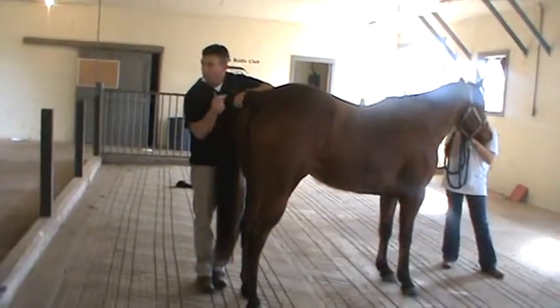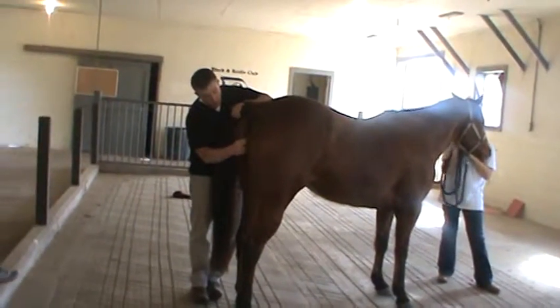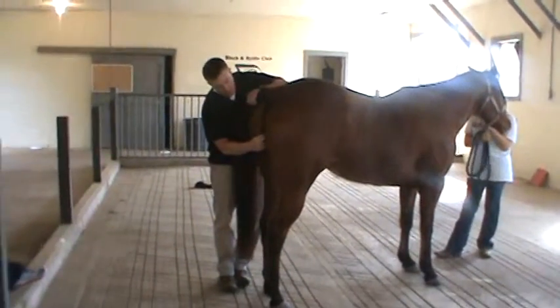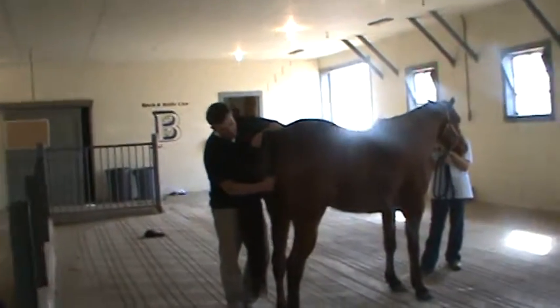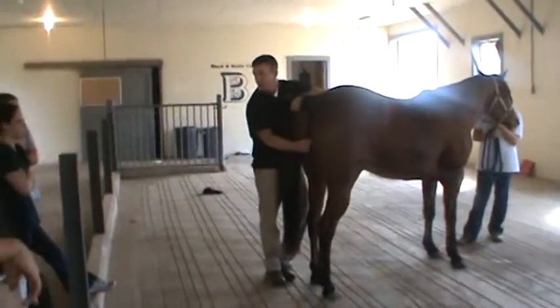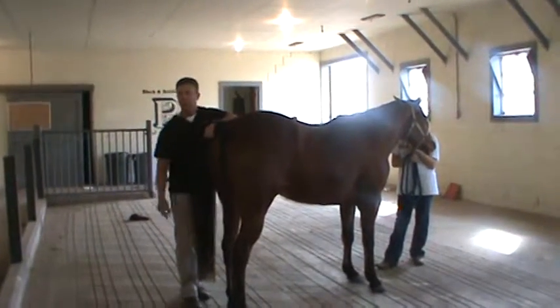It's a fancy way of saying where those lips meet. You know, is there a good closing when it's just there normally and naturally? Here on the bottom is the clitoris of a horse. It has a pouch, a pocket, a diverticulum. It's called the clitoral fossa, if you really want to get technical about it. And we look at that just to make sure that there's no infection there.